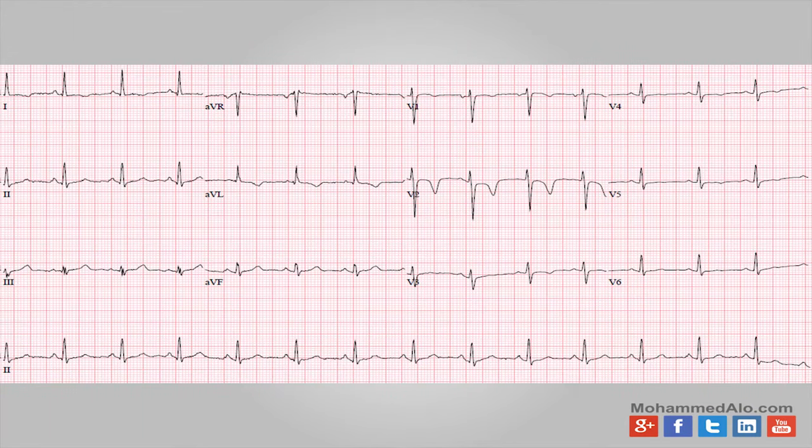Next EKG shows some inverted T waves in V2, almost like that Wellens looking shape. You want to count the QT corrected interval to see if it's under 425 or not, but for Wellens criteria, it usually is wider than that. So that may or may not be anything there. Just check a troponin, keep getting EKGs. It will reveal itself. But this is probably the closest example we have of a Wellens.